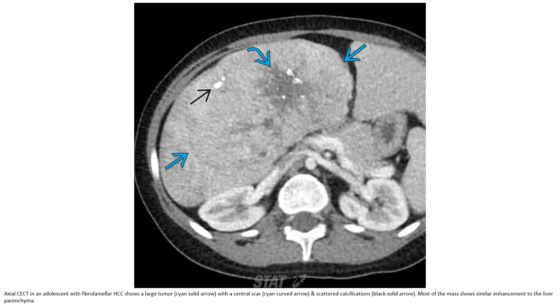Contrast enhancement in a case of fibrolamellar HCC shows a central scar and scattered calcification. Most of the mass has similar enhancement to the liver on MRI.